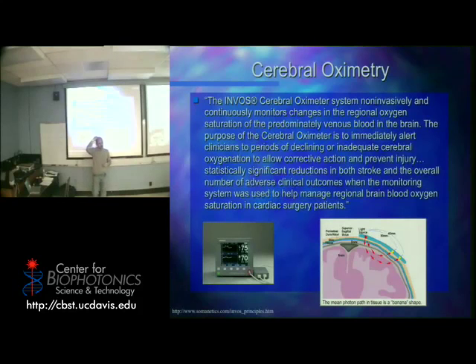If I put a really, really bright light source here, the way light travels in your brain is in the shape of a banana. They have determined that the majority of light, the way it scatters and interacts with all the bones and tissue and brain, comes back from the surface about 30 millimeters away, 3 centimeters, and then comes back from deeper parts of your brain about 40 millimeters, or 4 centimeters, away.